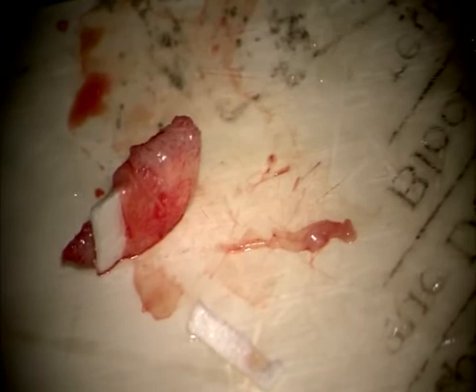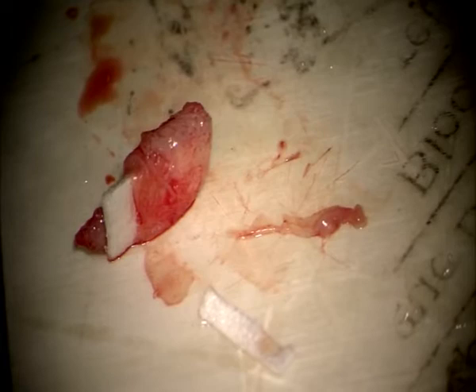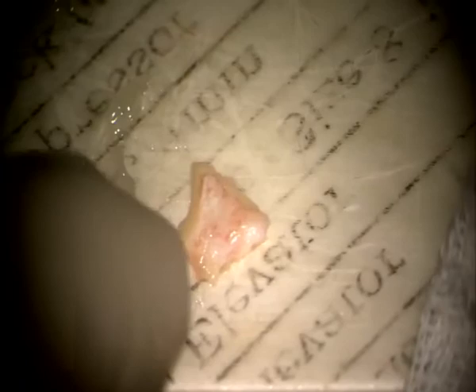You need a cartilage? No. Oh, there's a cartilage? Yeah. Okay, let me see it. Leave that alone. Give me a sponge. Sometimes I take a piece of cartilage in case I'm missing something. Give me a round knife. I probably won't need this. Give me a sponge.